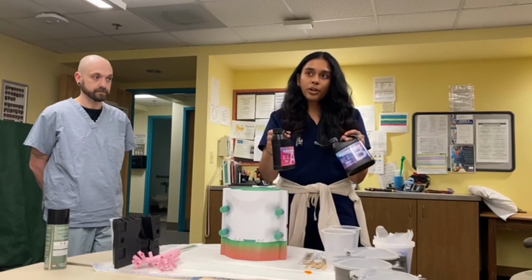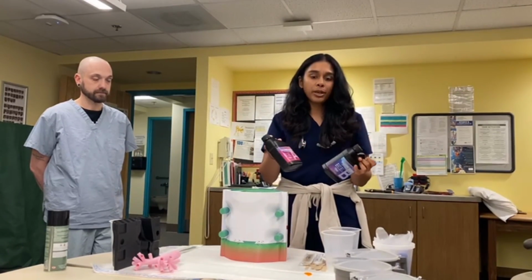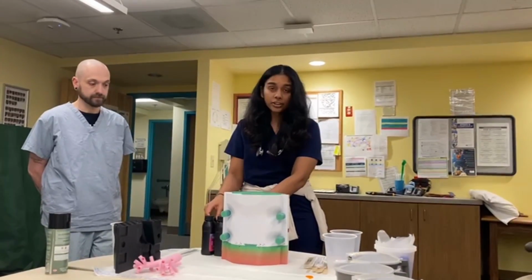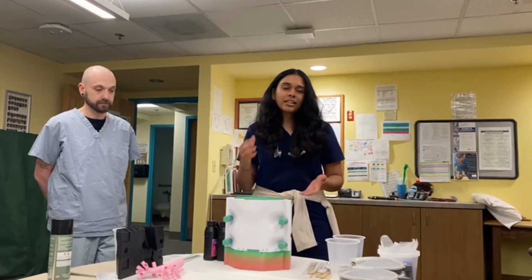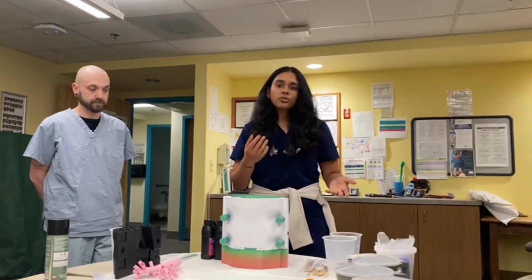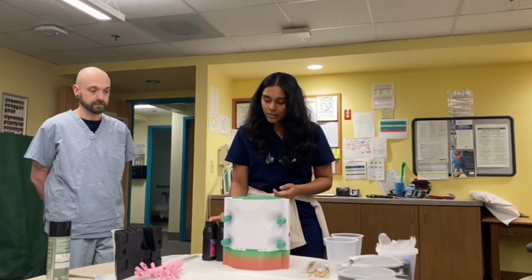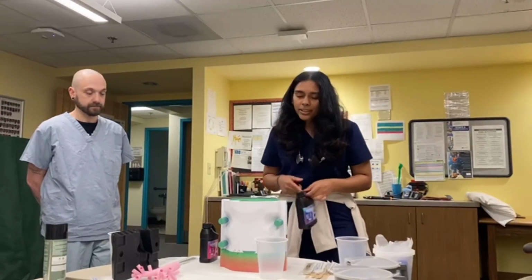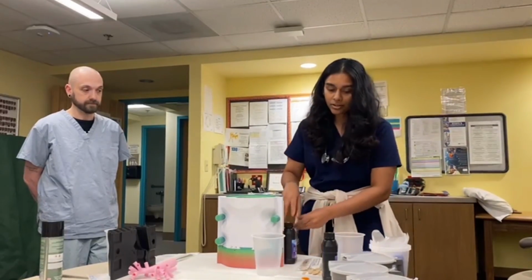So that comes in two parts, a part A and a part B. They're to be mixed in an equal 1:1 ratio by weight. You can find a lot of different kinds of silicone rubber with different hardness. What we're using here today is a 15A. That's kind of in between where you're not going too soft where it's crumbly versus too hard where it becomes like a solid piece. We already have them portioned out in 19-ounce bottles, so we're just going to mix those two together.